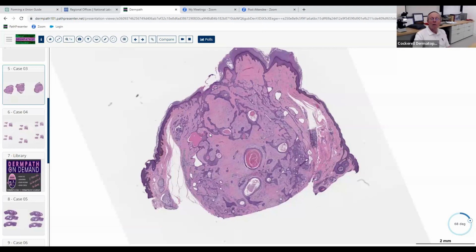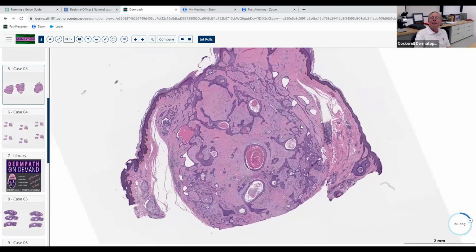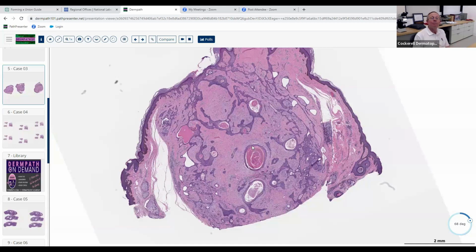Yeah, it's pretty small, well circumscribed, vertically oriented. And you think it's an epithelial or a non-epithelial neoplasm, or maybe both? I think it's epithelial. It's definitely epithelial, at least in part, right? You said cysts. Cysts are epithelial lined, so that means you've got epithelium somewhere there, basically. And then you see these little small aggregations here that look like epithelium.